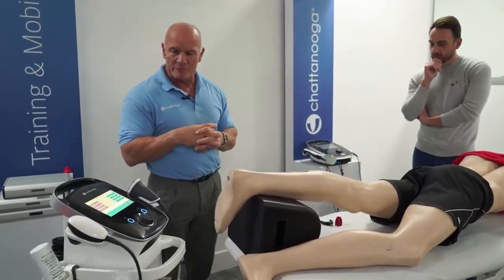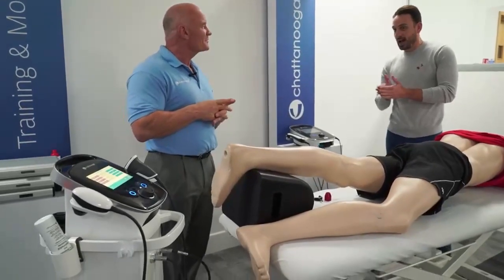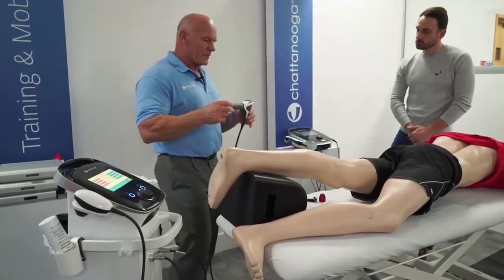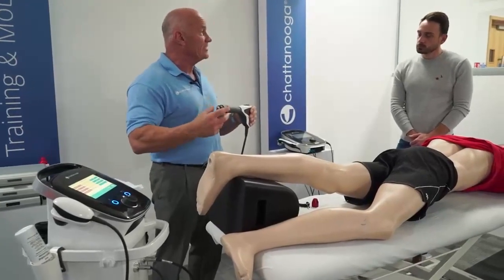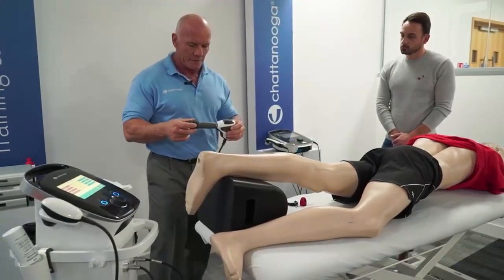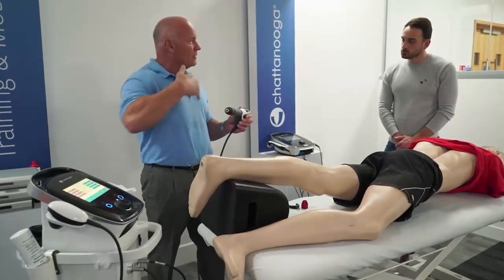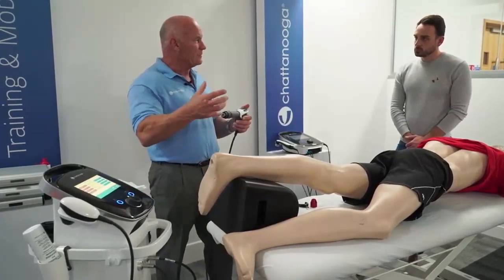Okay, excellent. Next question. It looks incredible, as we said. How do you look after it? Yeah, it's a great question. So I said that if you have an air compressor, it doesn't need much servicing. It doesn't need you to check things like oil levels and seals on a daily basis. So the compressor part you can just leave. Maybe once a year when you get your engineer to come and check all your other Chattanooga equipment, they can check inside, make sure nothing's come loose, but that's it.